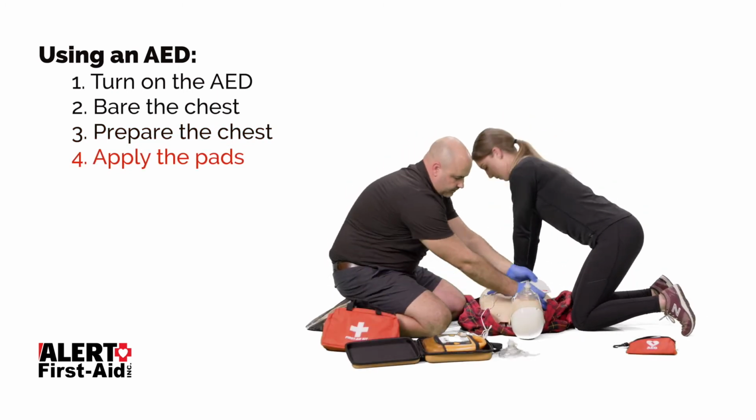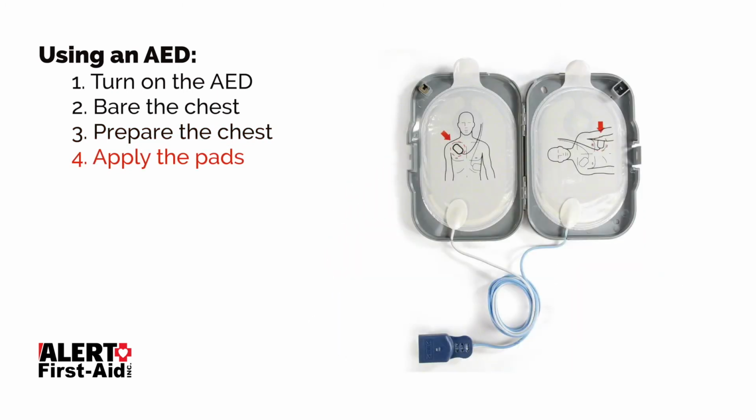Now we can apply the pads. There are pictures on the pads that show you where to place them. The placement doesn't have to be perfect, but get it as close as you can to the picture. Avoid things like pacemaker scars, piercings, and jewelry by at least an inch.